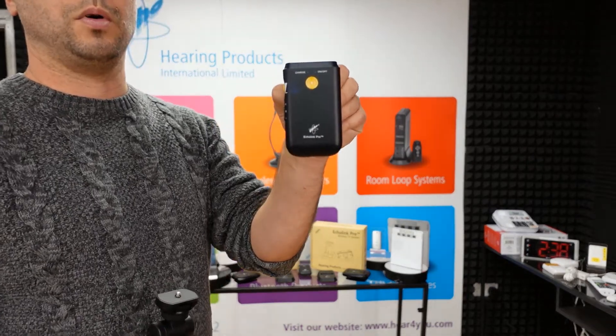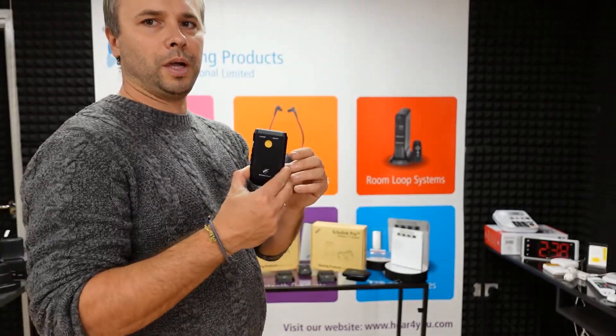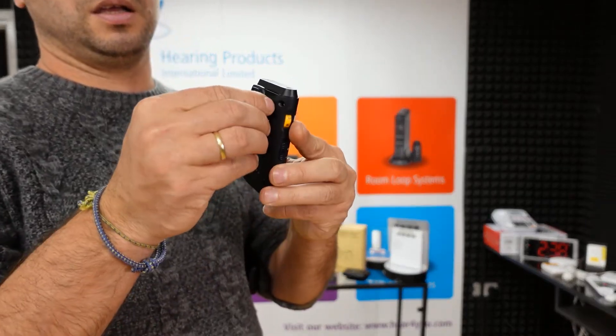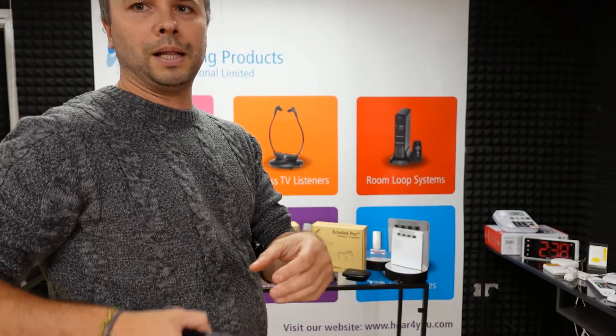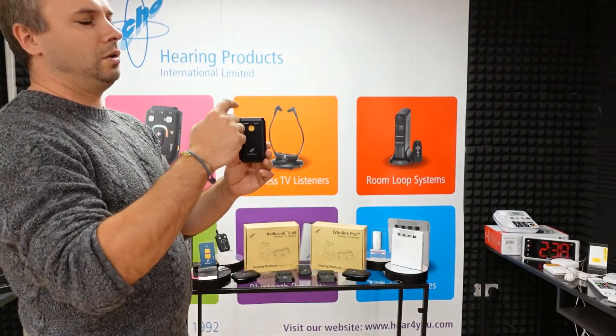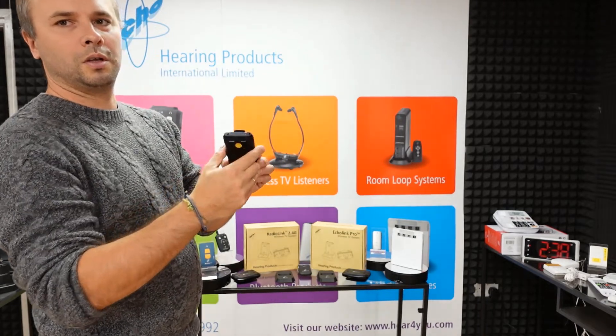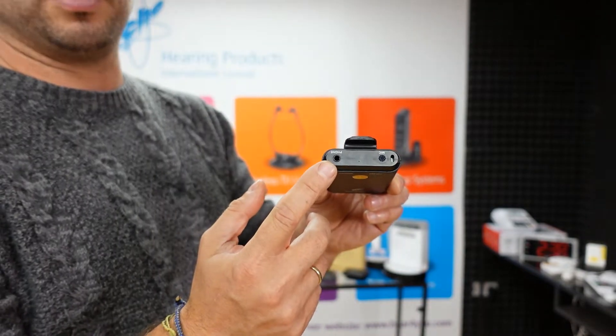The small handheld receiver you can keep in your pocket, or you can use the clip on the back to attach it to your belt. Then you connect your headphones or your neck loop into the jack here.